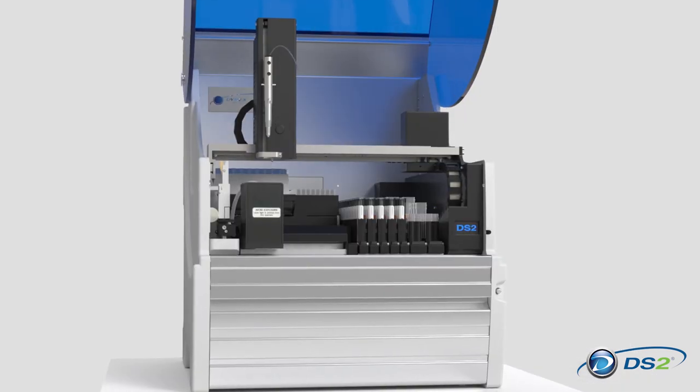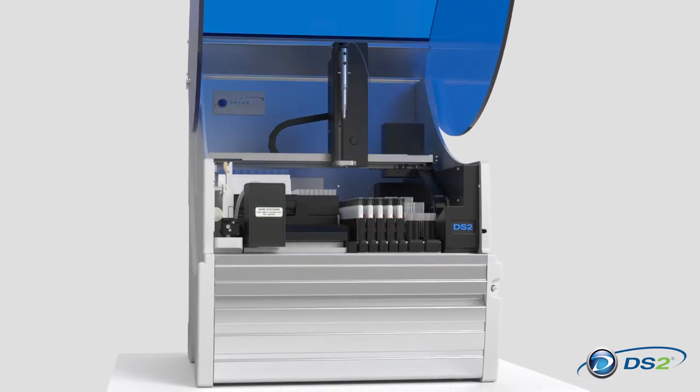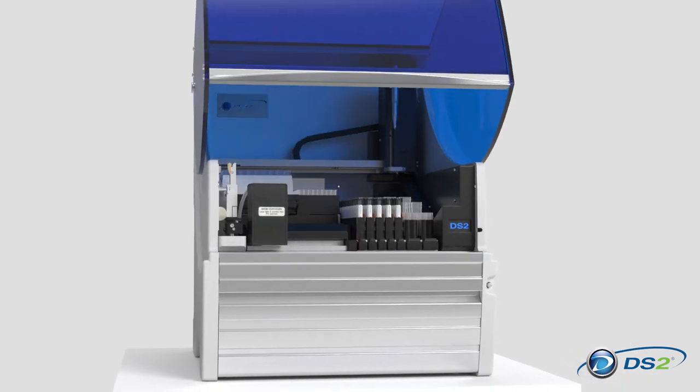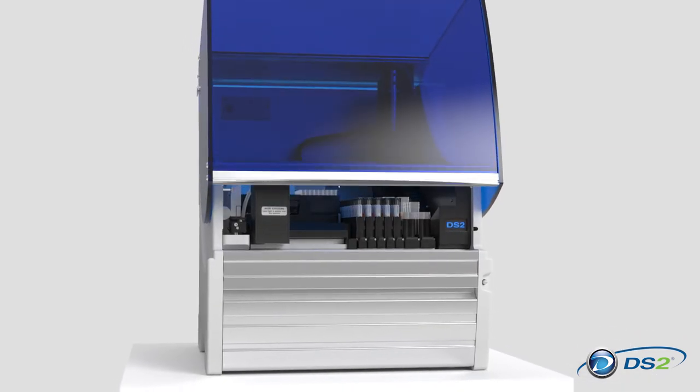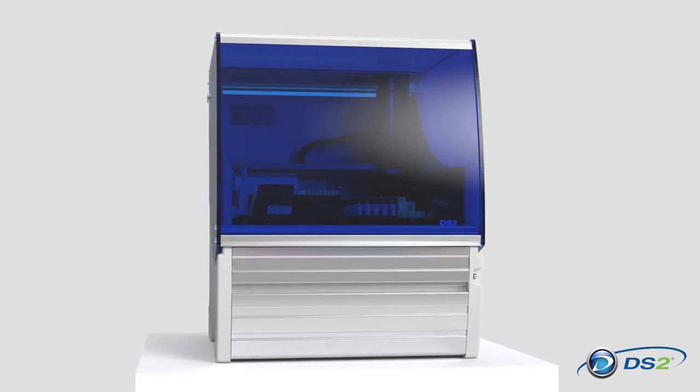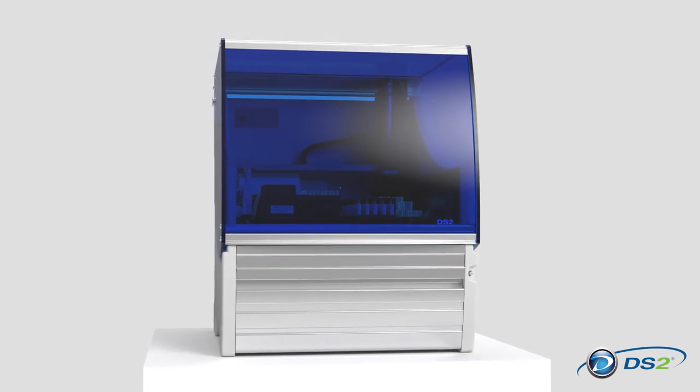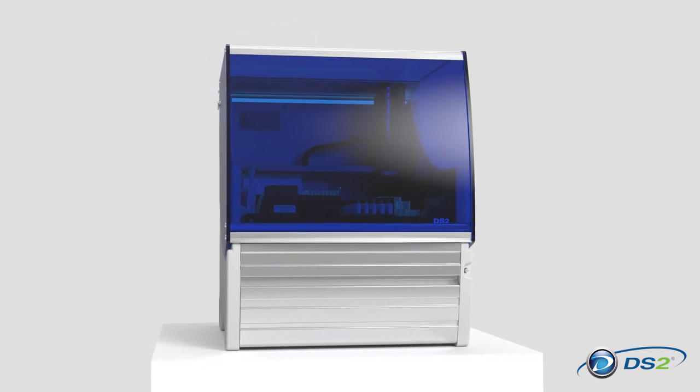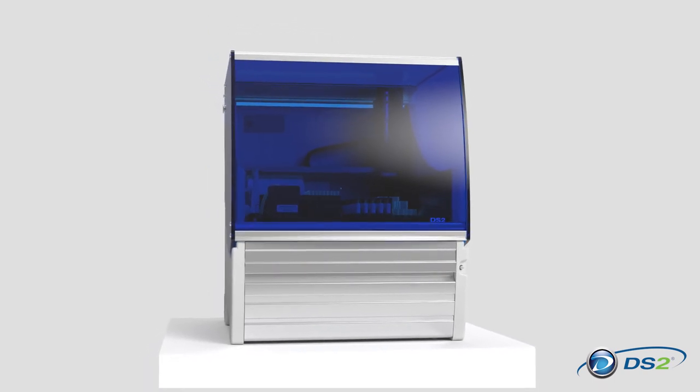A reliable, compact, and cost-effective solution for lower throughput labs, the DS2 by Dynex Technologies makes automation a reality.